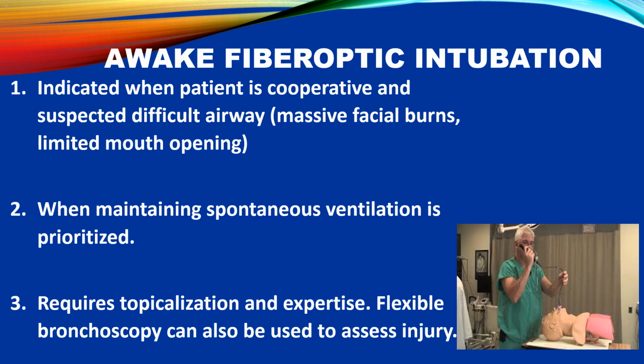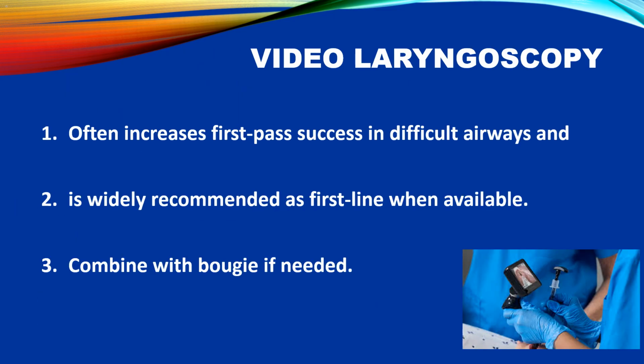Benefits. 1. Assessment of injury. Flexible bronchoscopy can be used to assess the extent of airway injury. 2. Controlled intubation. Allows for controlled intubation while maintaining spontaneous ventilation. Awake fiber optic intubation is a valuable technique for managing difficult airways, especially in patients with facial burns or limited mouth opening.